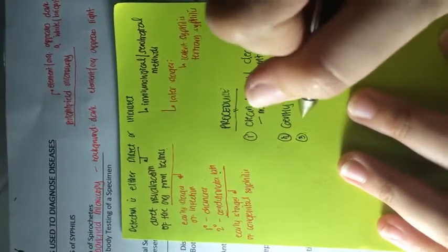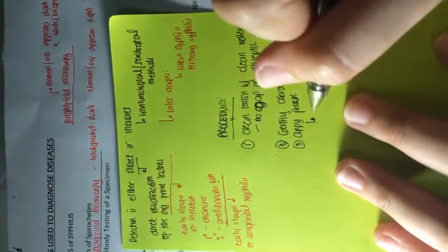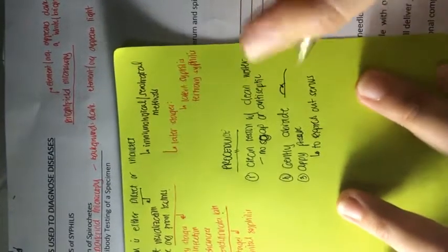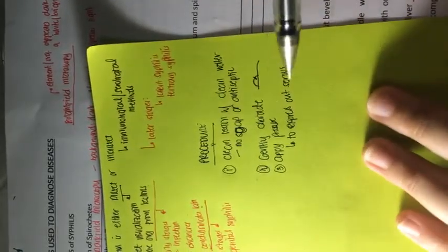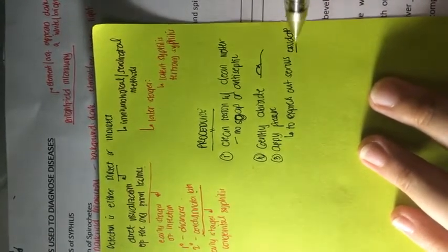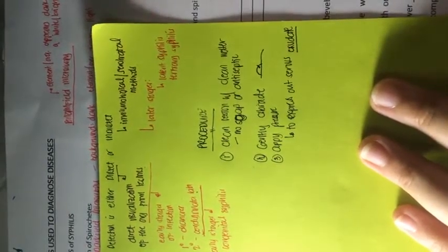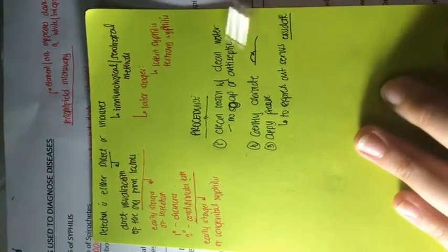And then after doing so, we need to apply pressure so as to express out the serous exudate. So we need to gently apply pressure so as to express out exudate. Exudate and transudate: if a serous fluid accumulation is caused by anything but inflammation, then that is transudate. But if it is a result of an inflammation, then automatically that is an exudate.